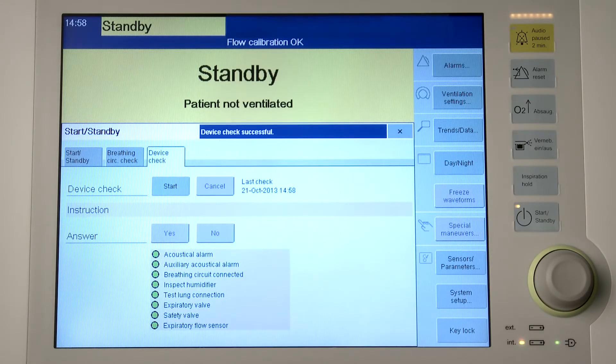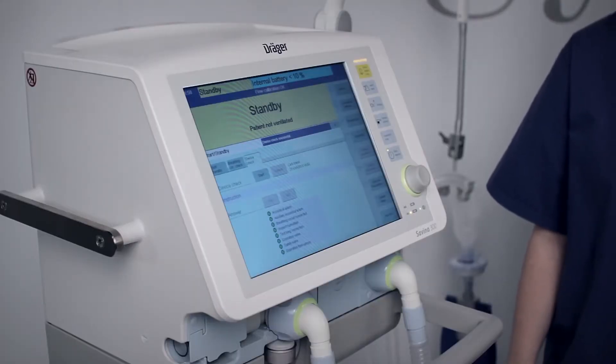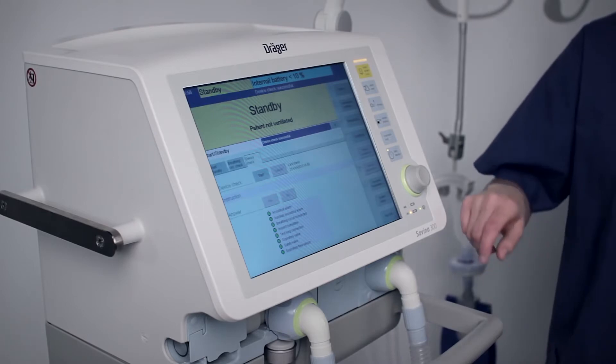After the device check was successful, perform a breathing circuit check. For the breathing circuit check, Savina 300 has to be in standby mode. You already selected the breathing circuit and the humidification type.